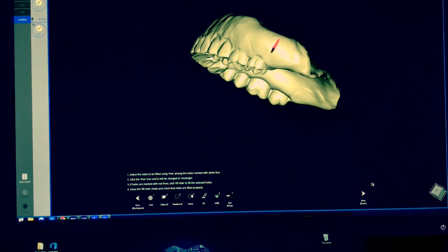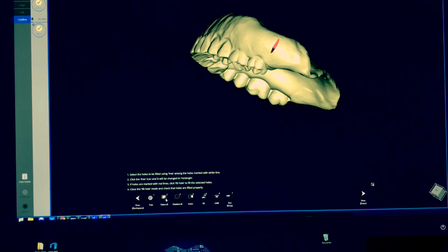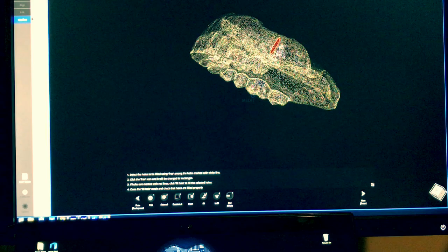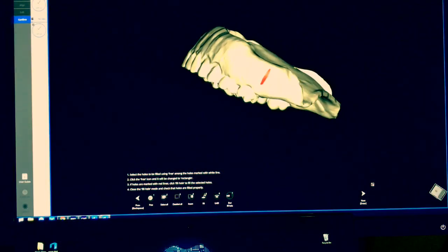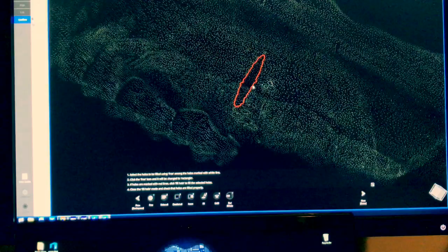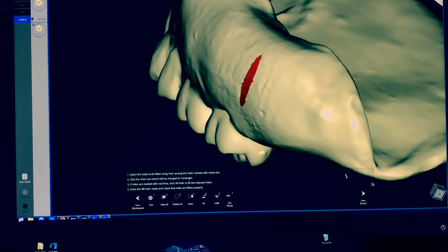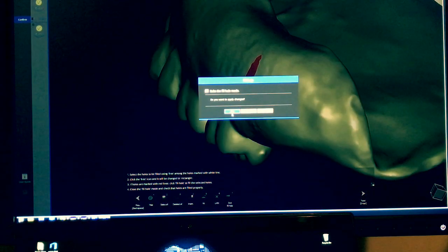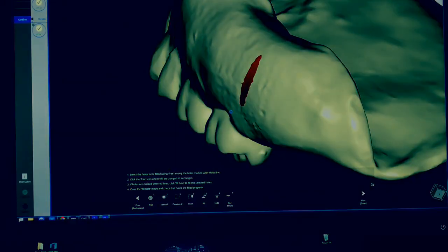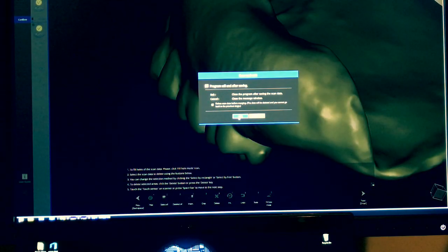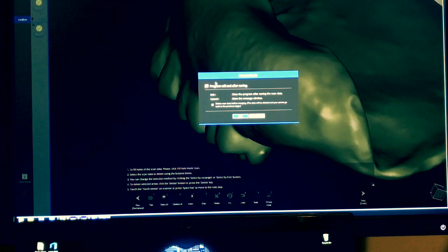This software has a really neat function here which is fill holes. You can basically select the hole right here - there's an option to select the holes - and then just click fill. There you go, it's really hard to see, but everything here in red is already filled. You just confirm that you do want to fill the hole, and that's it. That's pretty much the whole process. I hope you guys enjoyed.